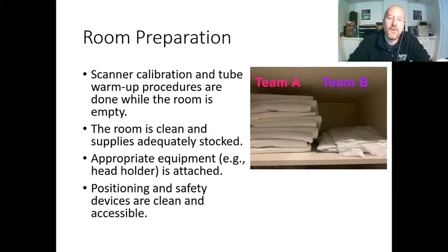All right, room preparation. These are all kind of no-brainers, but you want to warm up the scanner before anyone's in the room, right? Because there's radiation when you warm up a CT scanner. Make sure it's clean, because that is really the first impression that the patient has of the department when you wheel them into the exam room, and if there's like blood stalactites from the ceiling tiles, you're probably going to have a problem.